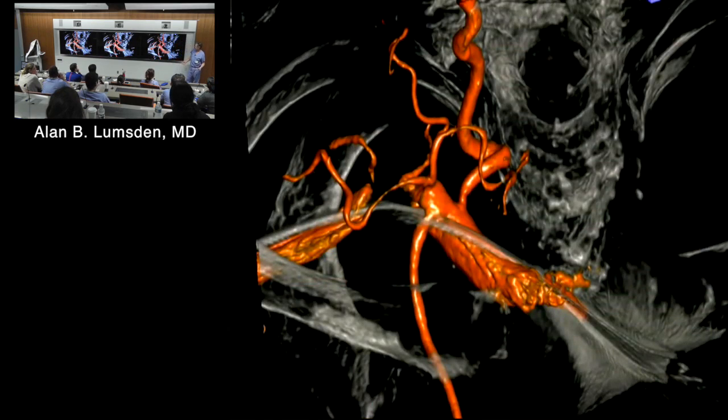This is a 3D reconstruction we can do in the operating room. So these new hybrid rooms are CAT scanners. That room back there, you probably should have a look at it, if you didn't see it yesterday, is the CAT scan in the operating room. We can create all of these things, and it's the world you're going to live in. It will transform how we do this stuff. You don't need to send a patient to radiology. We do our own CAT scan. We can use it to fuse images. We can use it to guide.